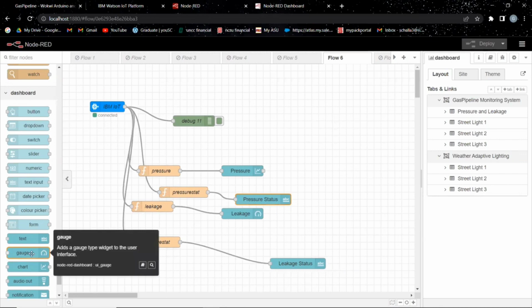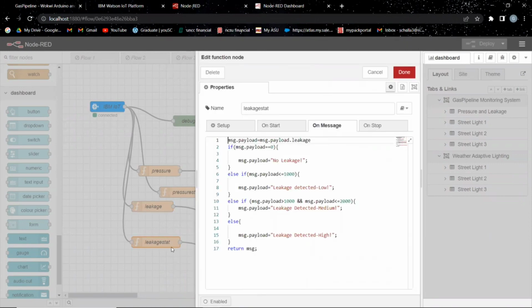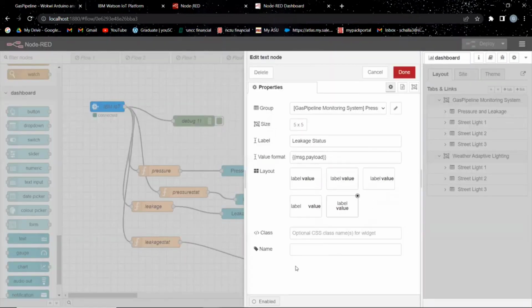So let me once show the leakage function as well. So double click on leakage function. So here instead of pressure, we give out the leakage values that we have obtained from the Wokwi. And less than 2000, then the leakage detector is of medium amount, or else the leakage detector is of high amount. So then click on done. And here for showing the leakage alert status, we use the text box. So double click on the leakage status text and configure it accordingly, like placing it in a normal group and proper label, providing the value format and layout as well. Then click on done.